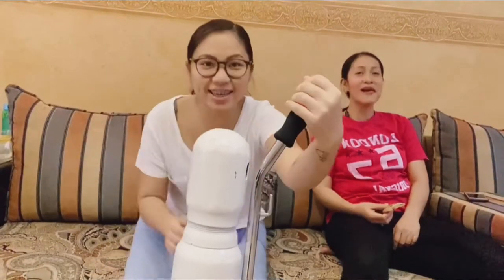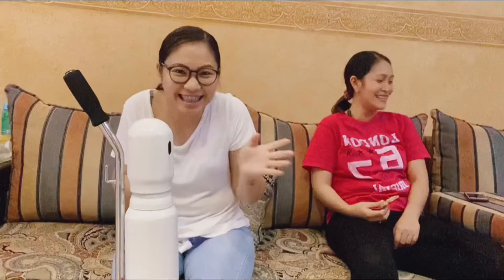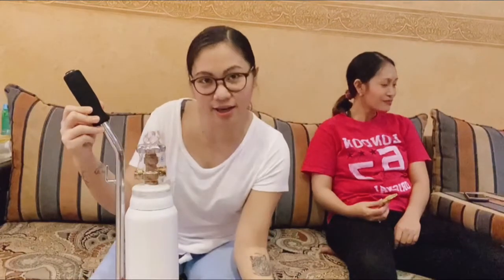Hi guys! For today's video, we will do an oxygen preparation. I'm preparing the oxygen because Umi is a patient for COVID-19. I will show you and teach you how to prepare this oxygen. This is the oxygen tank of Umi.